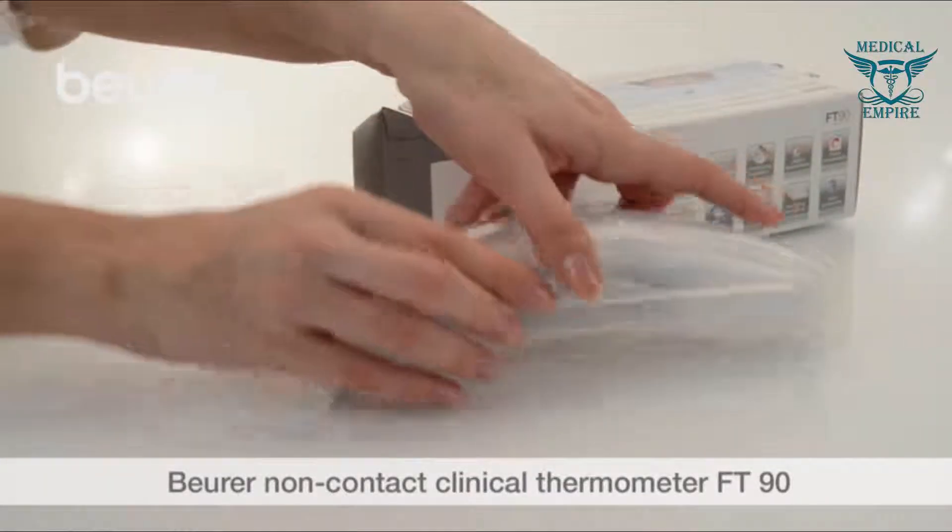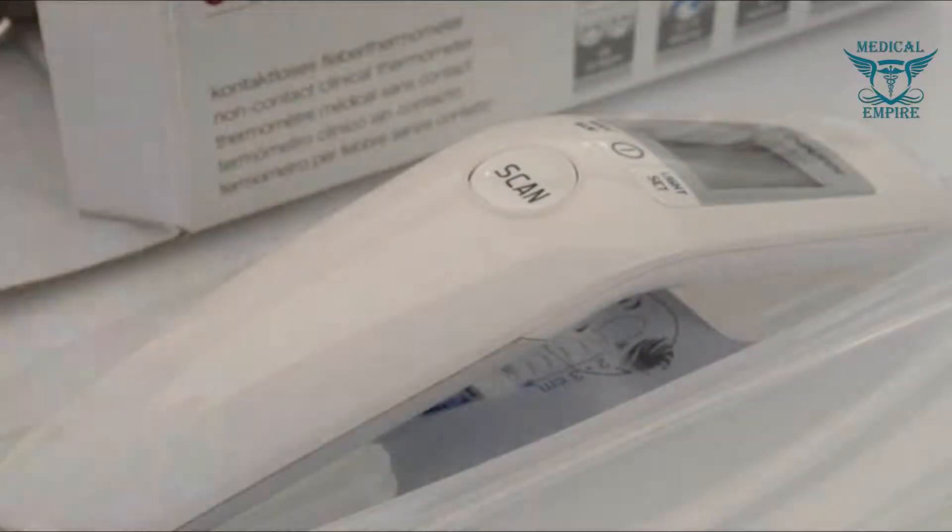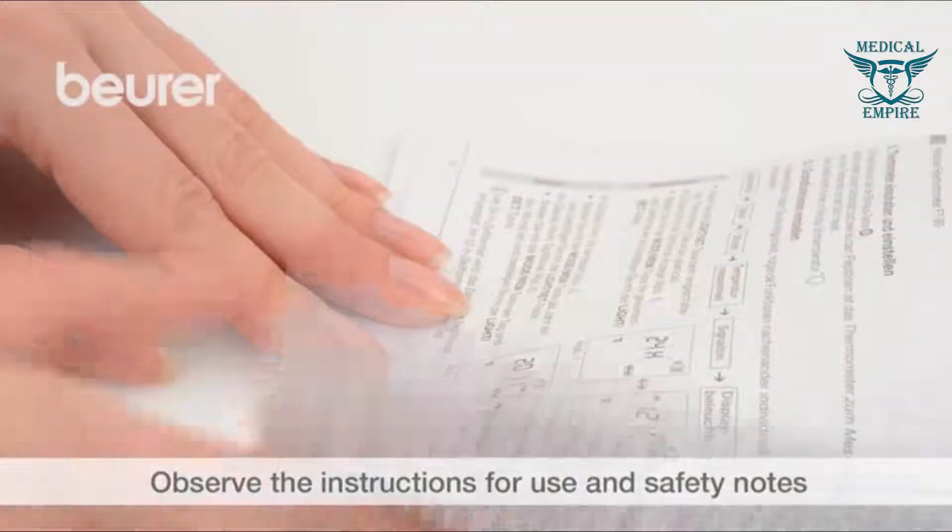Here are some tips on using your non-contact FT-90 clinical thermometer from Boira. Pay attention to the instructions for use and safety notes.